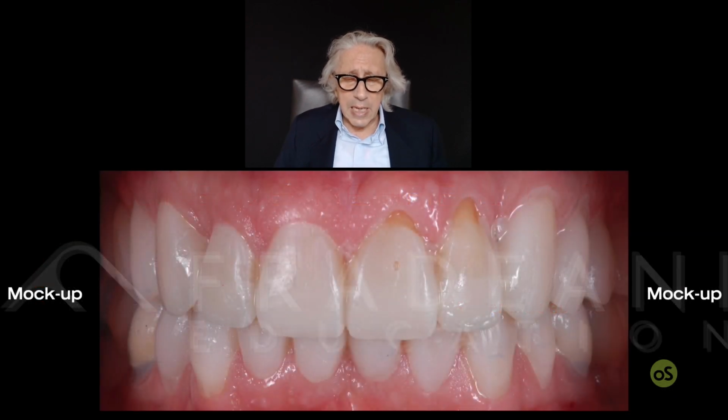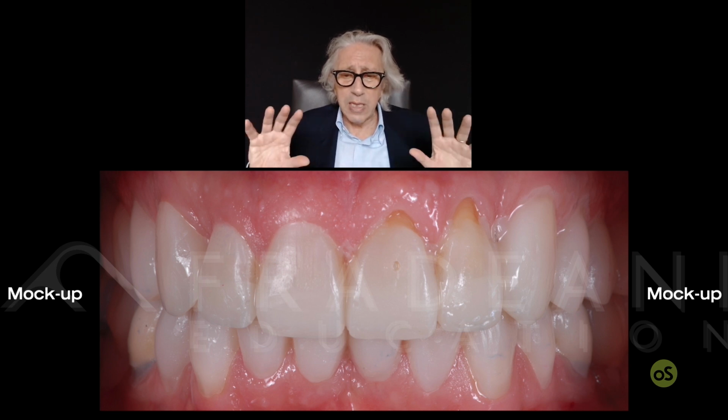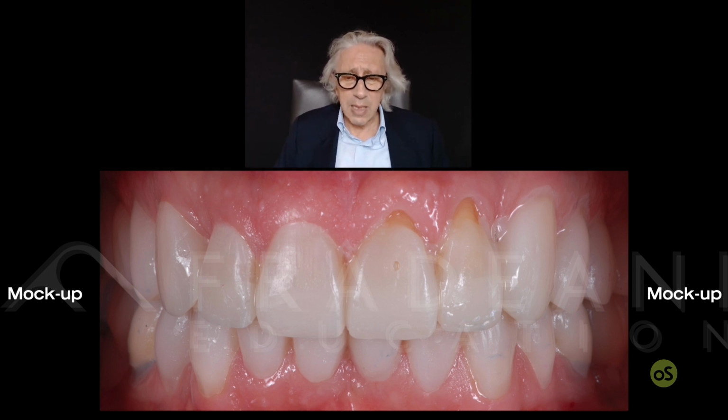The next picture I will show you is the best picture I can show you. The best one. Why? Because it's incredible what you can really plan in advance. This is the mock-up that we made at the beginning, okay? That was before we started any kind of work. It's just a preview without touching any teeth, just printing over 100%.